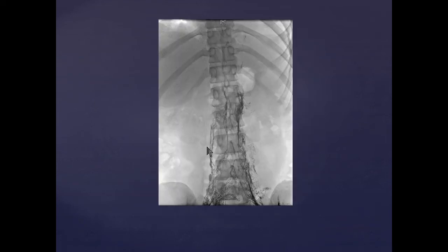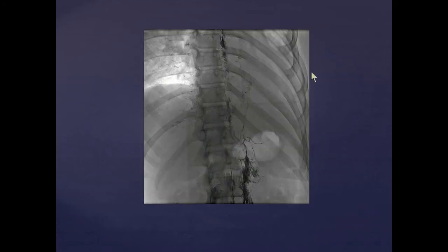Get up into the abdomen, you can kind of see that tripartite architecture that we talked about. And at this point, I want to make sure I've scouted up at the thoracic inlet, because a lot of times the transit really starts moving pretty quickly at this point, and you're not really filling a contrast column to the tippy top. And you want to be alert, because sometimes you'll get here and you go, wow, the contrast just sort of stalled. And then you go up to the shoulder and you see the upper part of the thoracic duct, and it's full of contrast, and things are quite well along.